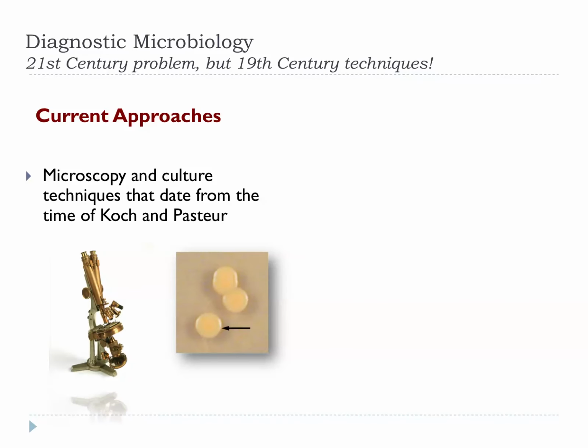So the problem with diagnostic microbiology, particularly diagnostic bacteriology, is we're kind of stuck in a groove, a 19th century groove, if you like, in that we're using in the clinical lab microscopy and culture as the mainstays of diagnosis. And these are things that date back to the time of Koch and Pasteur. They would have been entirely familiar with the idea of looking down a microscope and growing things on solid media.